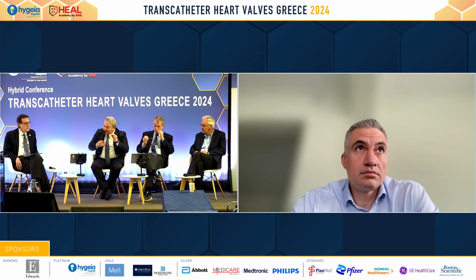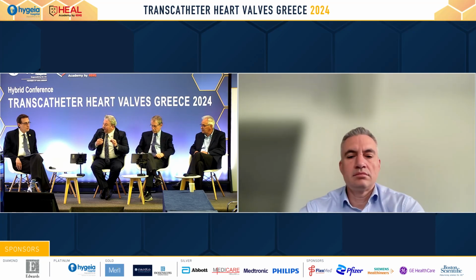As Dr. Riordan underlines, for the self-expandable technology, it's very important to look at the procedural where the capsule head marker is, center front or center back, especially in the cusp overlap views. So these all are very important for future coronary access. But my question may be, how many older patients, after TAVI, do you routinely use coronary angiography, or how many PCI have you ever performed for older patients?